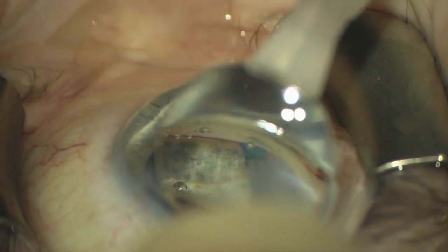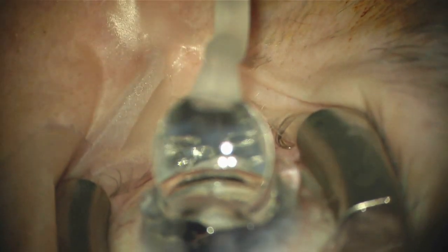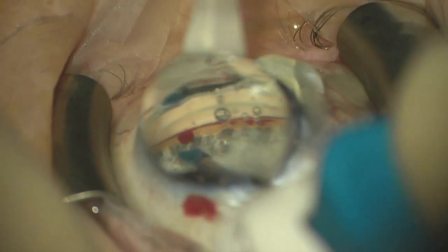As we readjust the lens and the pressure in the eye drops a little bit, you can start to see blood refluxing from those initial goniotomies. Then we're going to go to the far left of our view.